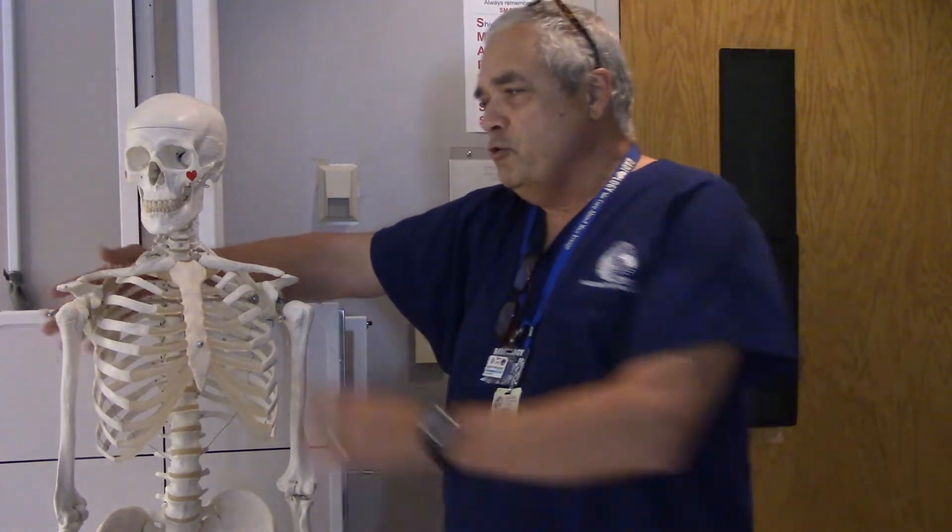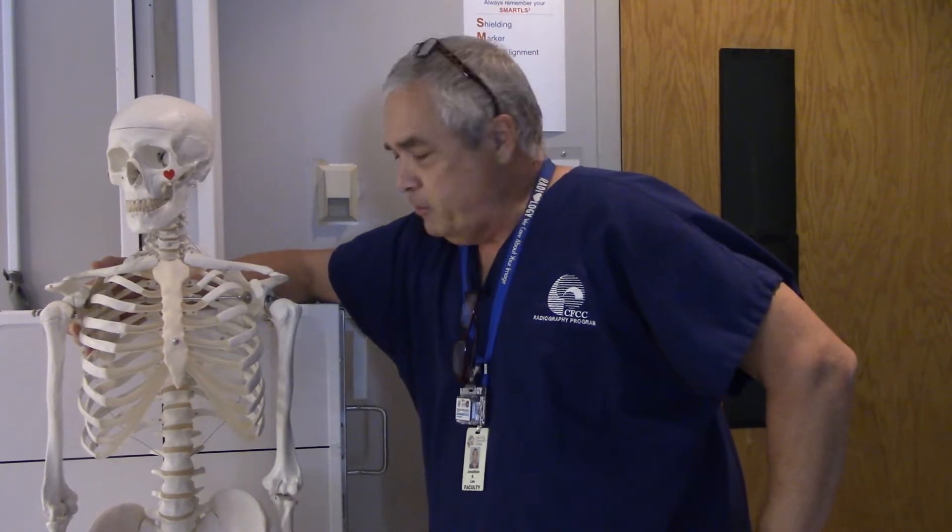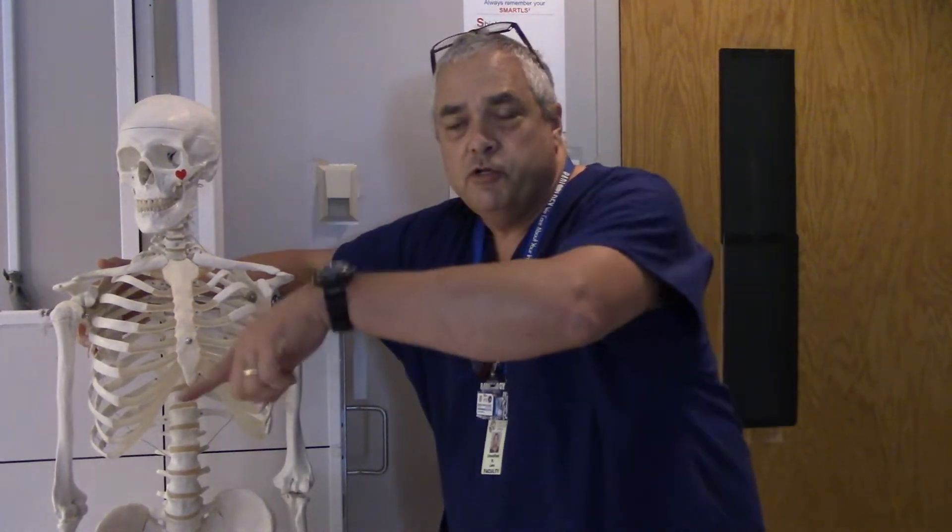X-ray Ed back with you once again with another informative and exciting episode of X-ray Education. As usual my partner Boney is with me right here. Today we're going to be demonstrating the correct positioning for upright abdomen x-rays and flat abdomen x-rays.